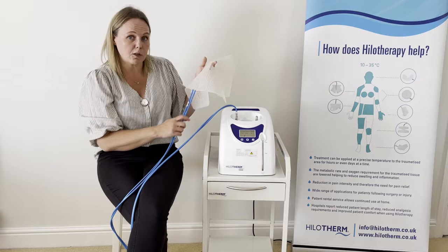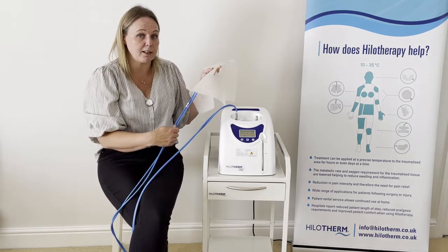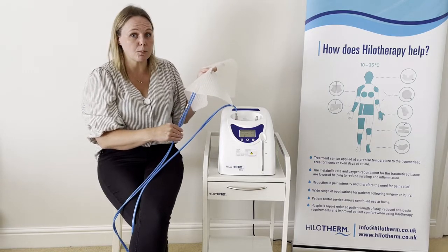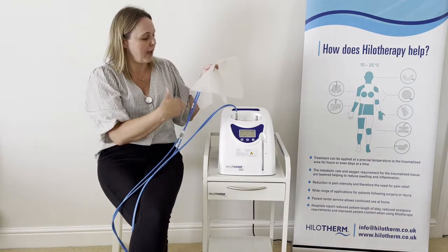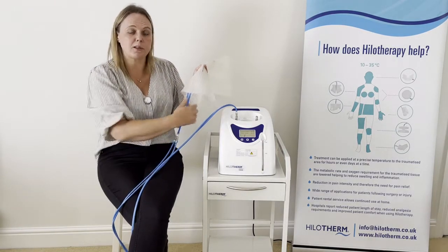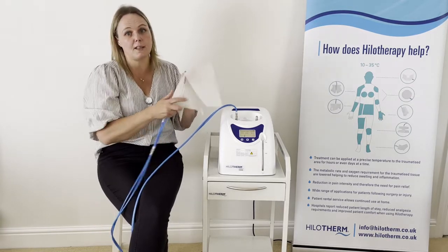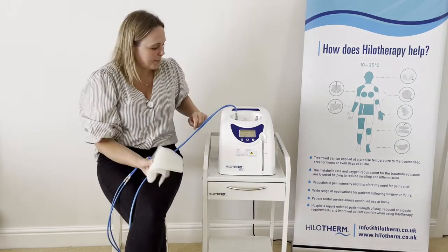We have a very popular rental service where patients can rent a smaller machine to use at home. When a patient is leaving hospital, we recommend they take the cuff home with them, as it can't be used by anybody else. Please do allow them to take it in case they decide to rent a machine from us.